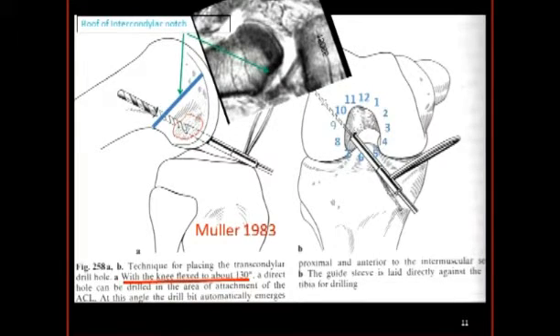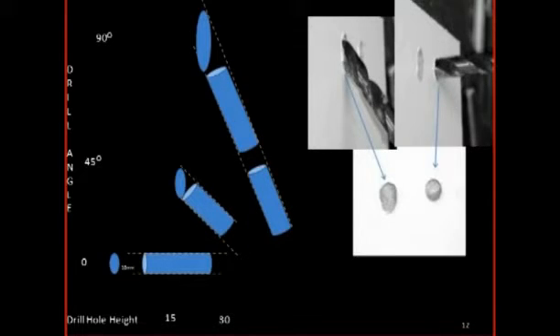And he showed, as was later emphasized by Leo Pinchevsky, that maximum knee flexion permits access to the lateral femoral condyle at the proper position and in a direction more perpendicular to the lateral wall and at about 8:15 on the clock, but only if the drill enters from the level of the joint and not through the tibia. A more vertical inclination of the course of the drill into the medial wall of the lateral femoral condyle produces an oblong hole that is greater in dimension than that resulting from a transverse course. The amount of increase is directly proportional to the amount of divergence from a transverse course.